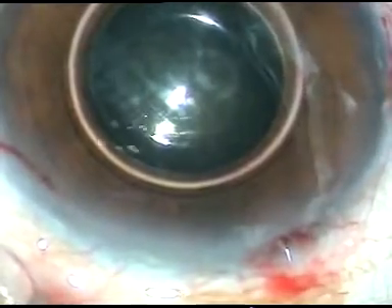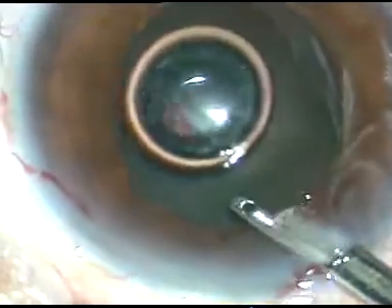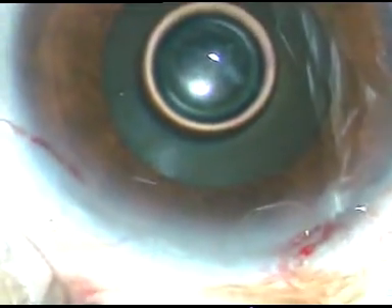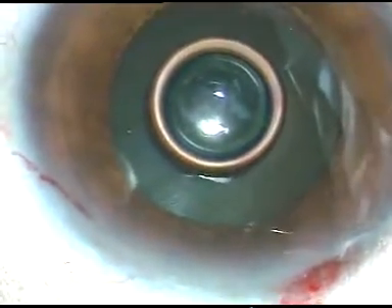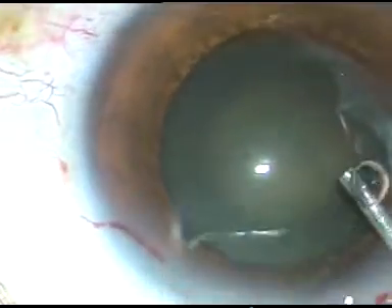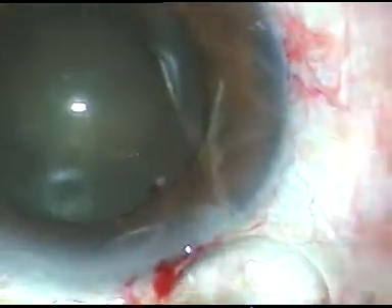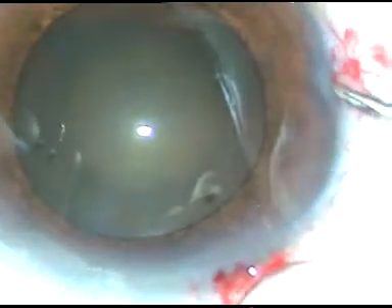Now I wash the dye out and replace the air bubble and BSS with viscoelastic substance. This is HPMC — hydroxypropylmethylcellulose. With application of viscoelastic substance, the pupil has dilated quite well. Now I am going to do capsulorhexis.